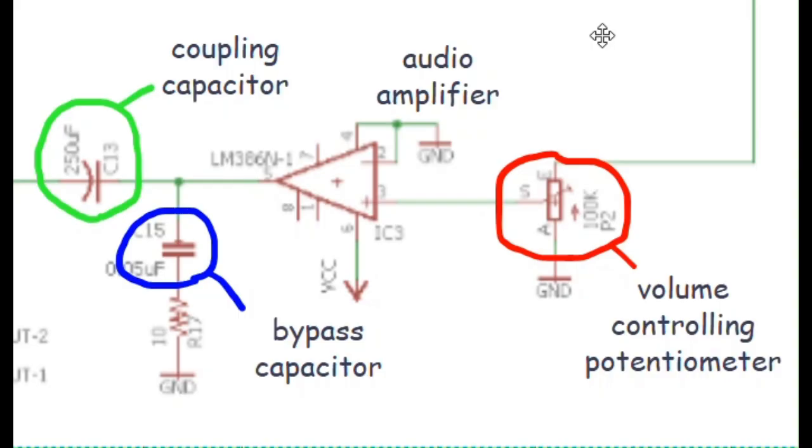But not least, we have block 4, which shows an audio amplifier. LM386N-1 is a low voltage supply audio amplifier. Here, we have a coupling capacitor C13 that allows AC signals to pass through but not DC signals. We have C15 as the bypass capacitor, whose main purpose is to reduce power supply noise and improve output stability. And lastly, we have P2, an adjustable potentiometer which controls the output volume of the whole circuit.